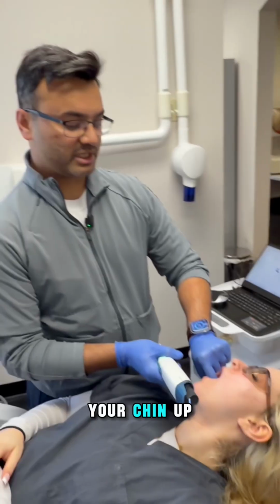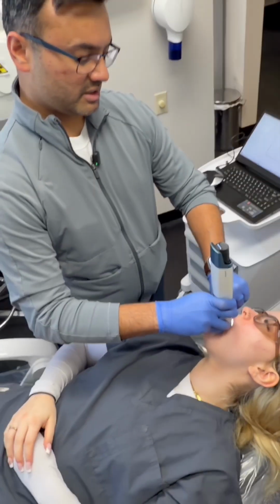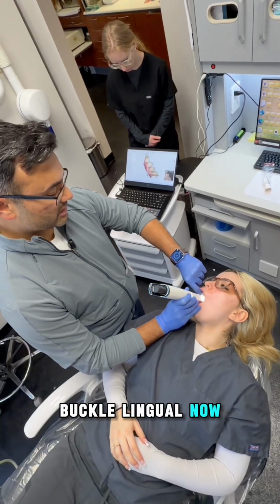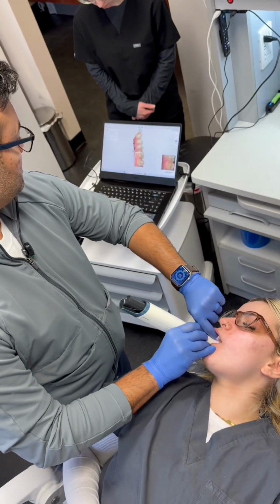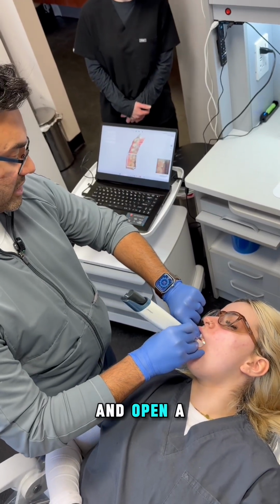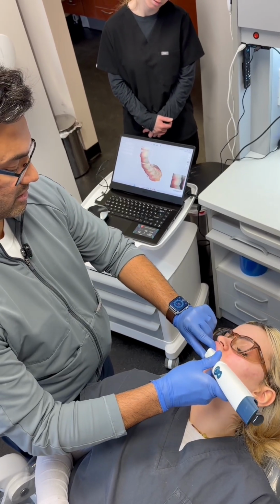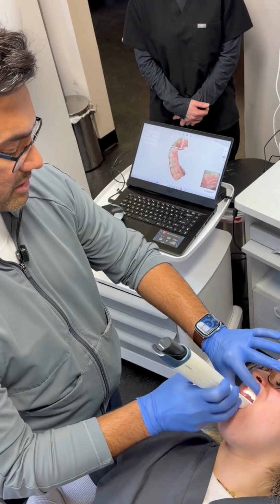Open wide, lift your chin up to the sky. Good. Stay open, buccal lingual. Now relax your jaw and open a little bit. Good. And open again.